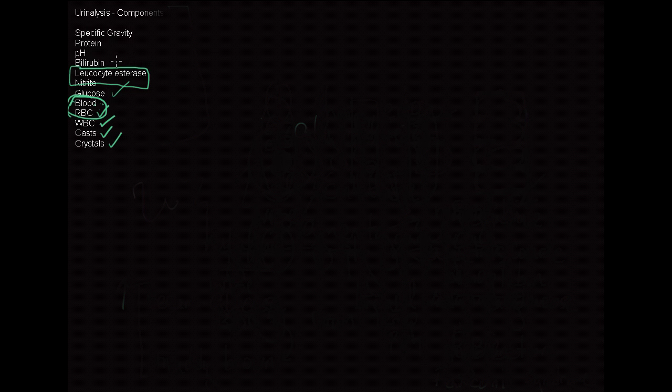Bilirubin, so as you know, it's direct bilirubin that is excreted through the urine. And the greater amount of bilirubin that's excreted, the more yellow your urine is. Of course, your urine can also be yellow if you have limited amount of water being excreted, say you're dehydrated or hypovolemic. But generally speaking, a person who's well hydrated, drinking normal amounts of water, who has very yellow urine, probably has that because they're excreting a lot of direct bilirubin. And you will have to evaluate that person for hemolysis or some kind of gallbladder or liver pathology to determine if this direct bilirubinemia, or bilirubinuria, is truly pathologic.